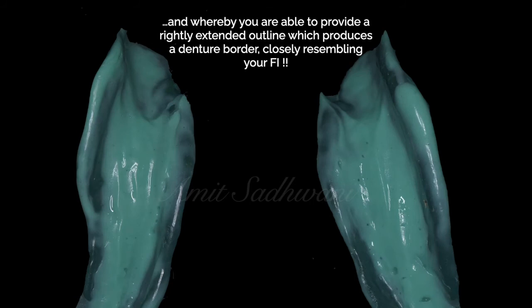And also you are able to provide a rightly extended outline, which produces a denture border that closely resembles your final impression. Mind you, your denture borders are just like your final impression borders.